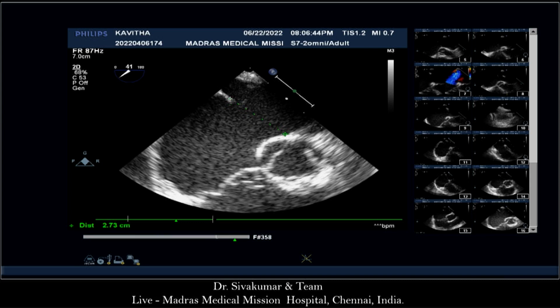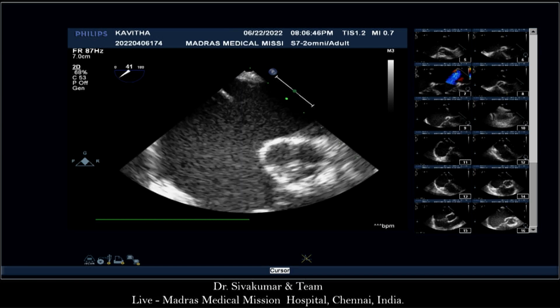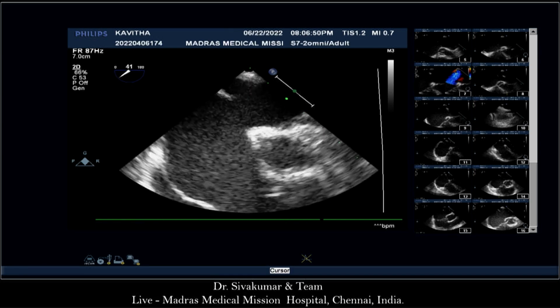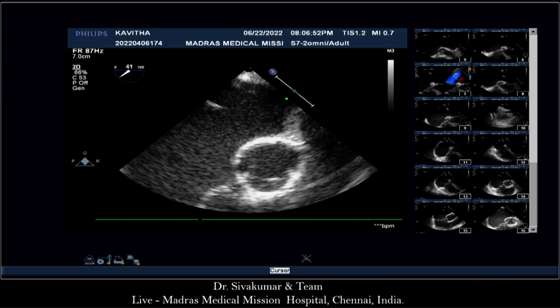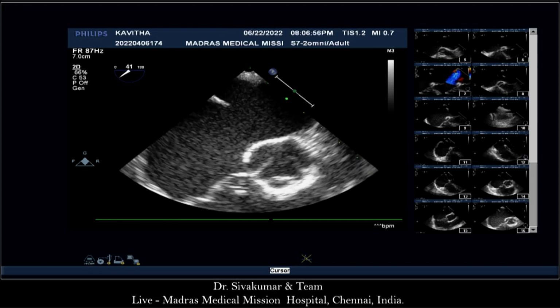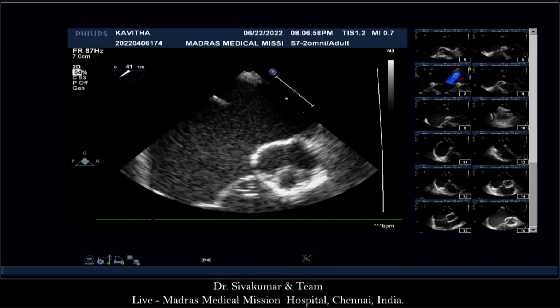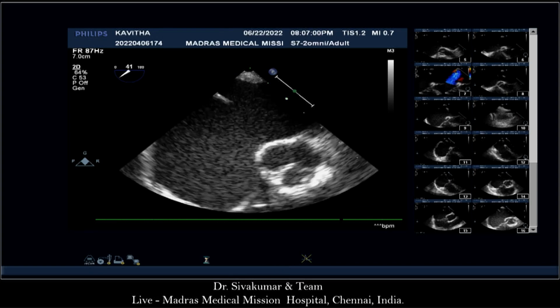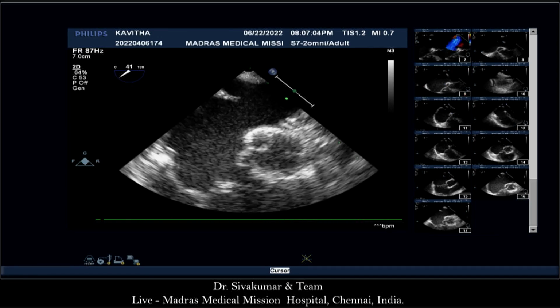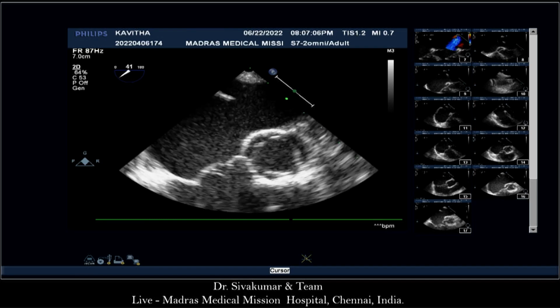No, stay in the middle of the cusp, in the middle of the non-coronary. Zahid, the ASD is not there. It is malaligned. Srija, pull it out. You see that it's going superiorly. You see the septum very clearly. They were right in the middle, around 10 o'clock on the aorta. Srija, slightly pull out and show that it is going more towards the left atrium.